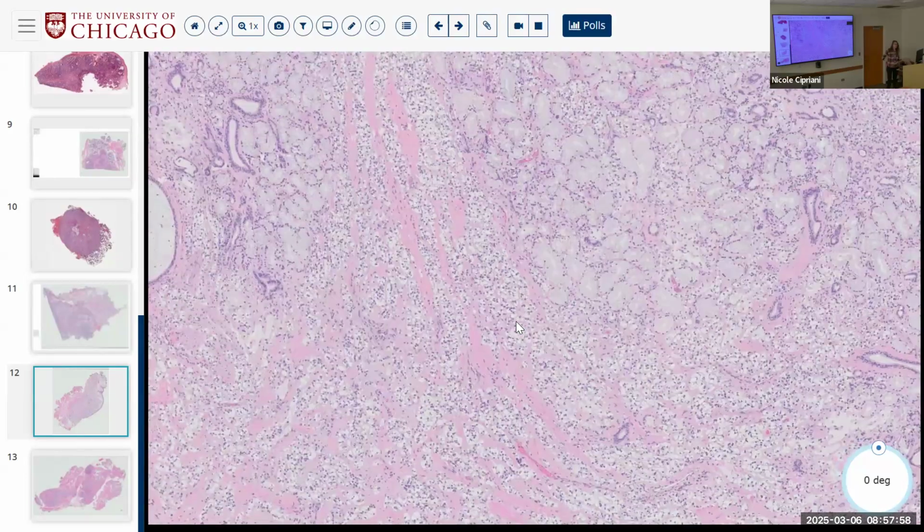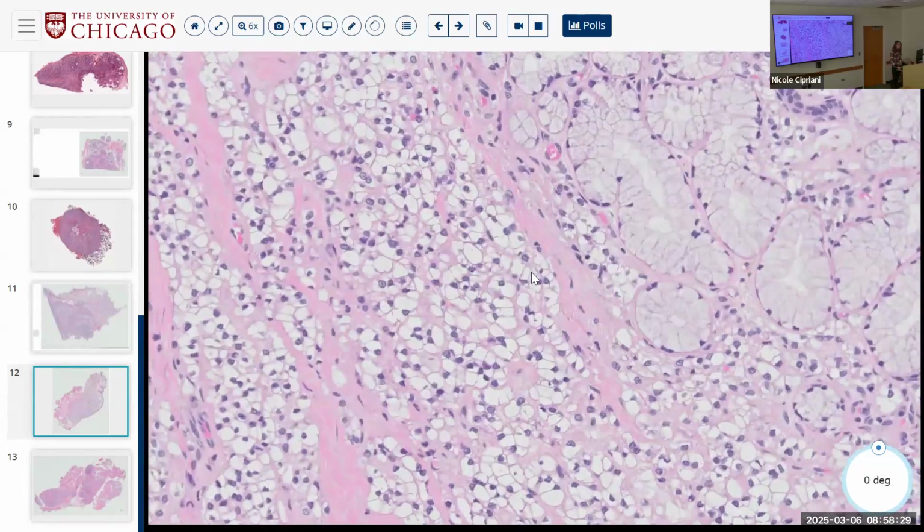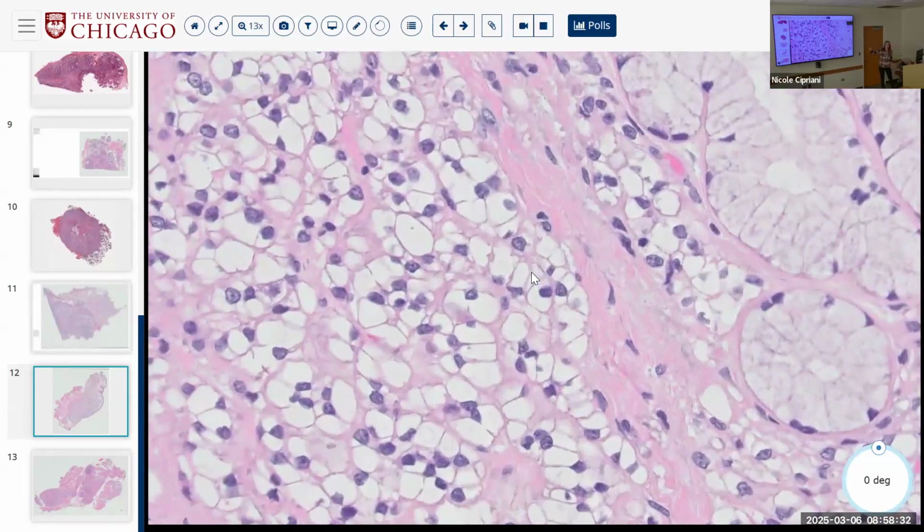We talked about the genetics of these, which are one of our favorite fusion partners, EWSR1 with ATF1. And we talked about the immunophenotype, right? These stain like squamous, high molecular weight keratin, P40, P63, but none of the other myoepithelial specific markers. No contractile markers, no S100, SOX10, right? Okay, so hyalinizing clear cell carcinoma, even though it's infiltrative, is generally of low morphologic grade.